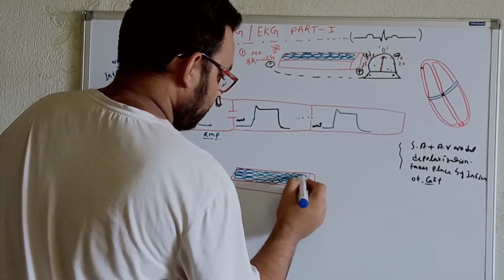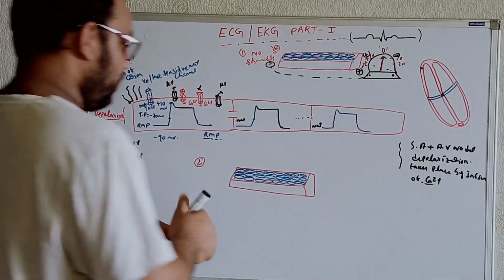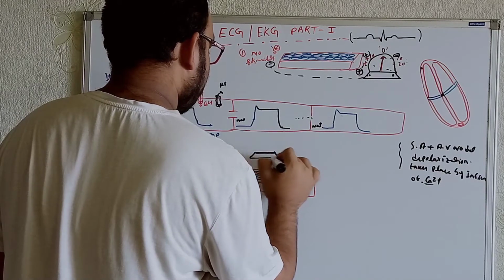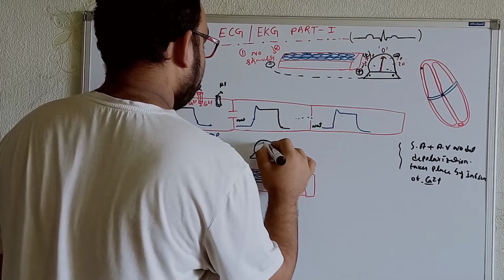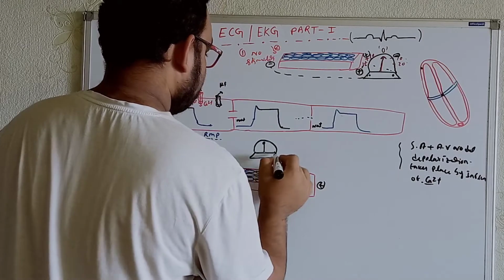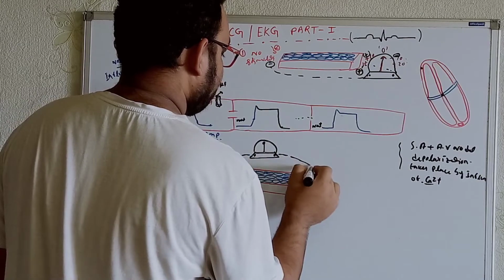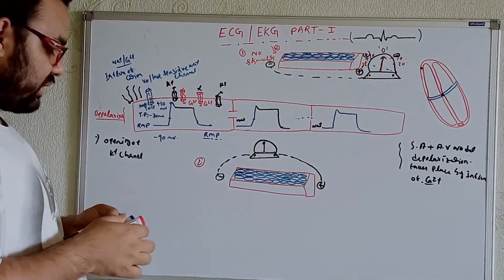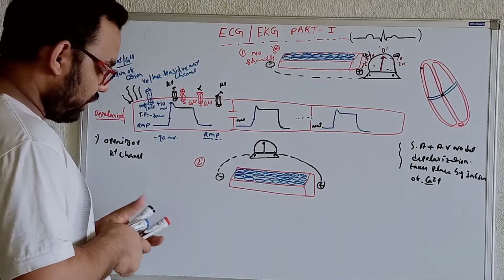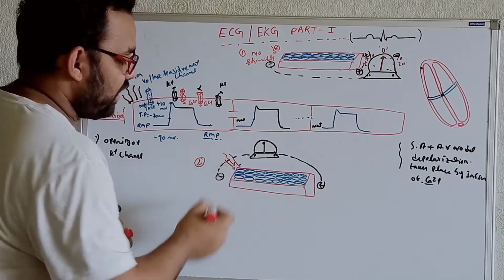Okay, now see. In this case, as I said, we'll take the galvanometer over here. I'm taking the positive side over here and the negative side over here. One is attached to the negative side, and in this case it is attached to the positive side. Now, for example, we are giving a stimulus within the piece of the myocardium. Whenever we get proper stimulation, as I already explained in the first part of the video, we will get the influx.